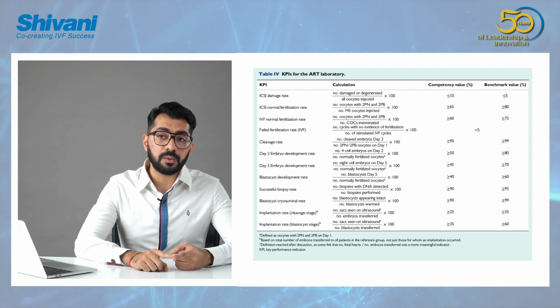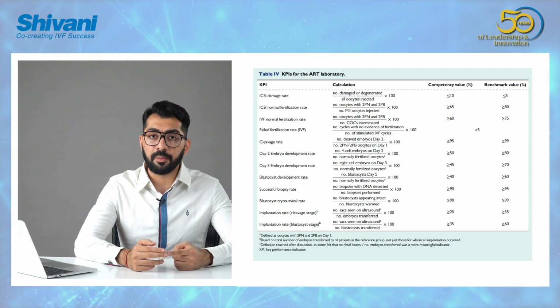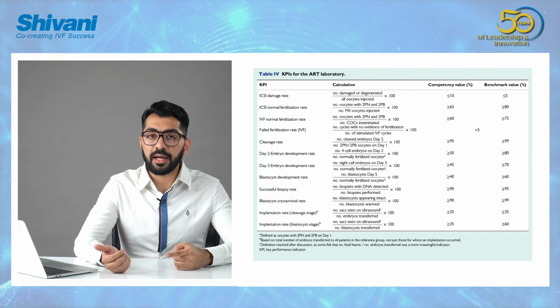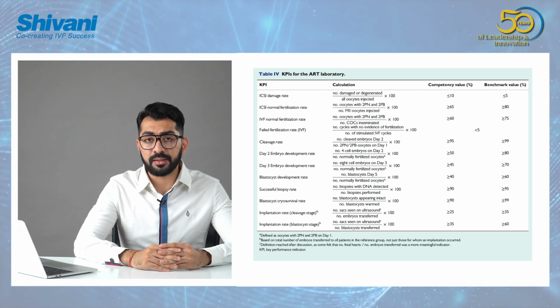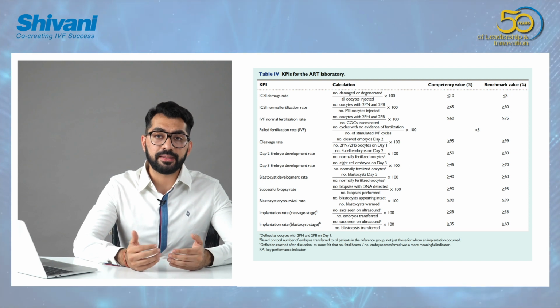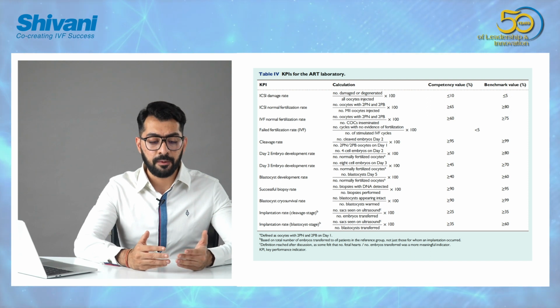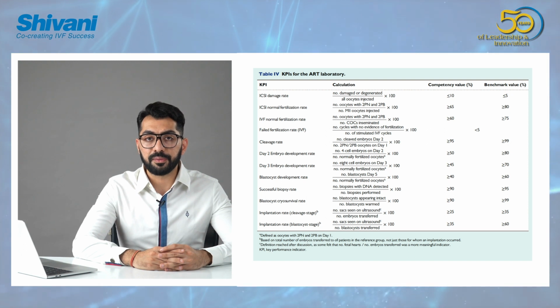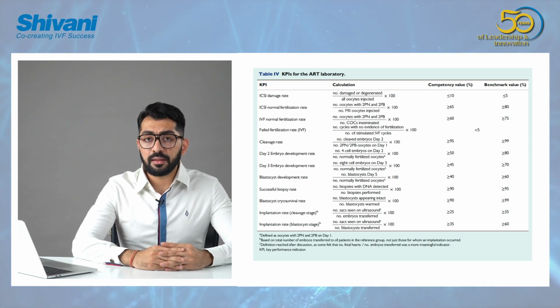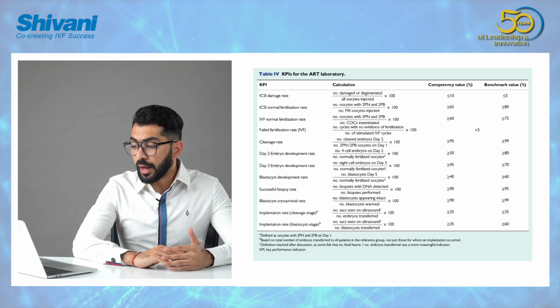It sometimes might also tell us about the quality of the embryos that are being frozen, because if you're, let's say, freezing a grade 2 embryo or a grade 3 embryo, you can't really expect a very high cryosurvival rate in that particular scenario. So that's also something that you can assess, and maybe in your laboratory establish a protocol of only freezing grade 1 embryos for cleavage stage, and for blastocysts nothing less than 3 BB should generally be frozen.